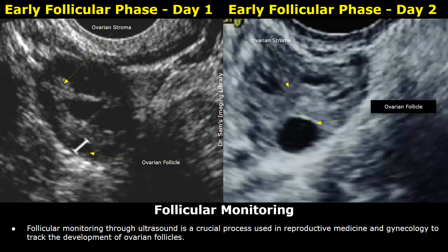Follicular monitoring helps to determine the timing of ovulation for natural conception or fertility procedures. Monitoring is done through transvaginal ultrasound. We will look at ultrasound images of the ovaries at different days of the menstrual cycle and learn how the follicles grow, how the dominant follicle appears, and what features are present during ovulation. After ovulation, you will see the presence of corpus luteum in the ovary.